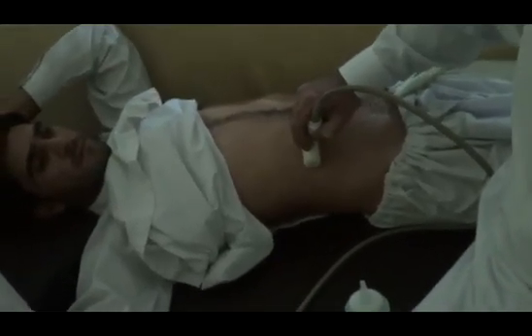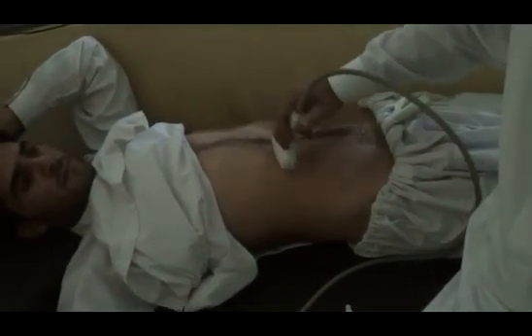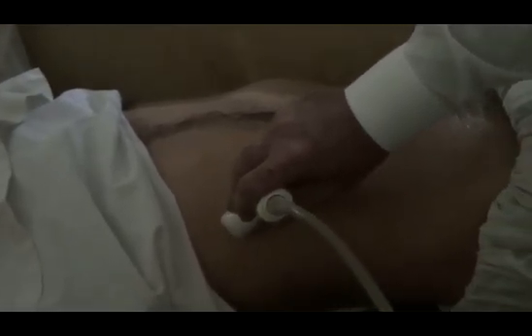A video to see the scanning plan for the gallbladder. The patient is supine posterior. Moving further, this is the subcostal region, this is the mid region of the xiphoid process, lower region, mid region, subcostal region. Rotate the probe, enter the subcostal region, and then angle the probe towards the patient's left side so that you will get this view.